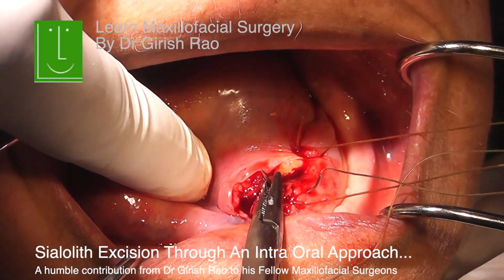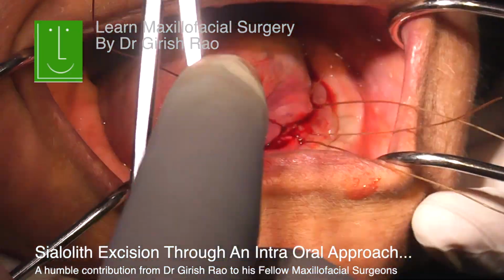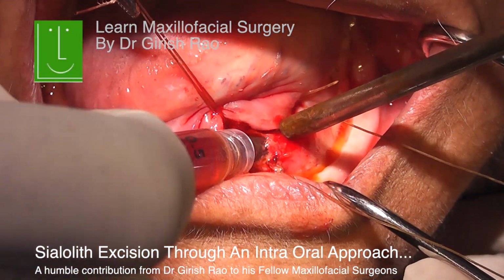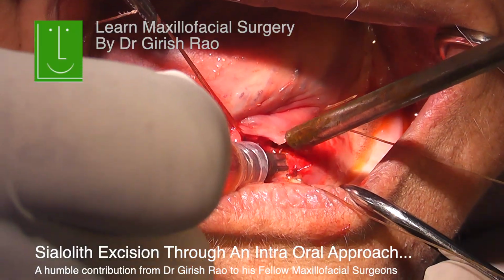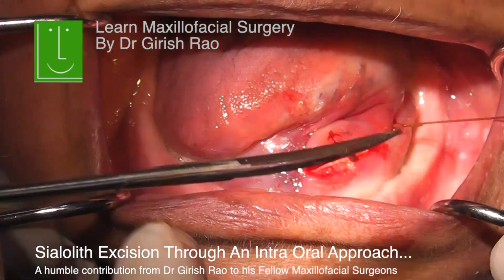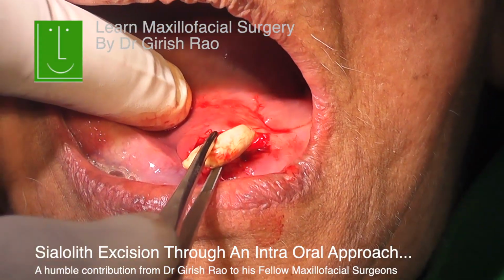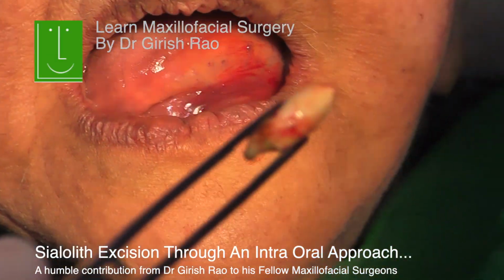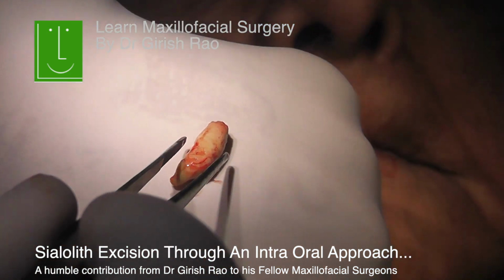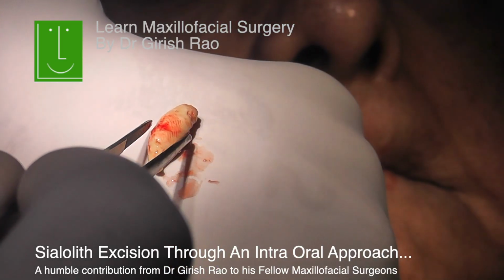Then it's a good idea to take a bite from the mucosa into the duct, basically one wall of the duct which we would have incised, and on the opposite side also. It's like the marsupialization which we do, so that the flow of saliva can happen. Again, a good idea to irrigate the duct so that whatever pus is there can come out. And leave it. You don't have to do a primary closure. Just allow the saliva to expel out, and it generally finds its own path and a new opening forms.